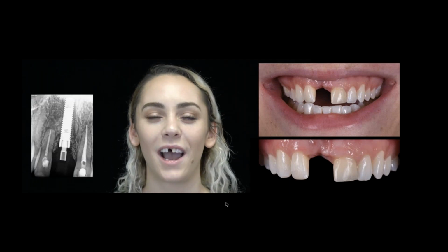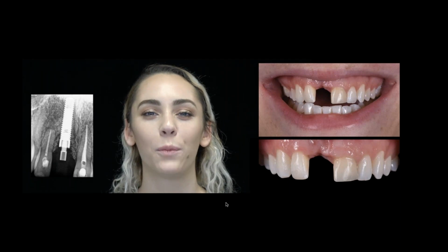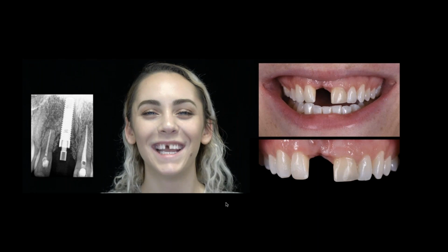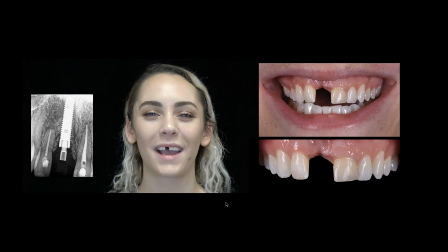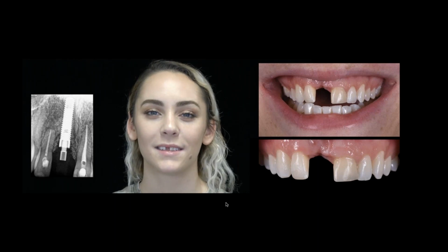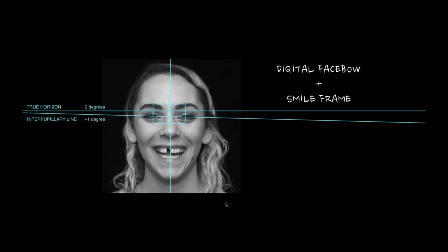Again, I don't want to go too far into this case, except to tell you that she also had some root canals on the adjacent tooth, and the implant that was placed wasn't usable. It really probably should have been taken out, but in our case, we decided just to adjust it and put the implant to sleep. We were going to make a bridge on it. That was based on the implant placement and position, and I was trying to manage her soft tissue, which is really critical for the end result and the aesthetics of this particular case.